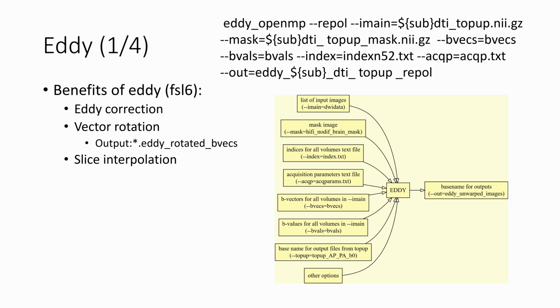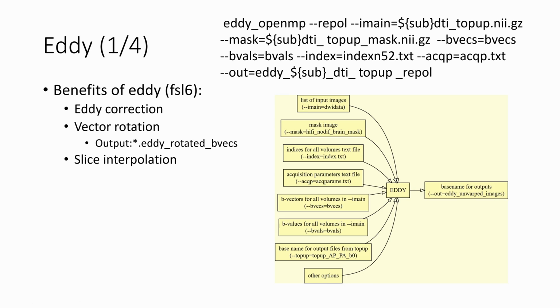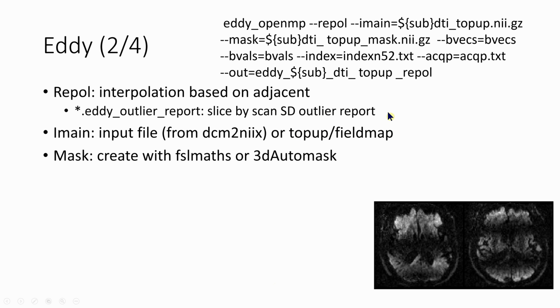Also you may get those blank signals as you are collecting across time, and it gets interpolated out so that your data is all misskewed and misaligned. You get those slice artifacts. The new eddy is an all-in-one where it starts doing all of this cleaning and creating new files for you to do better interpolation. So this is an example of the command.